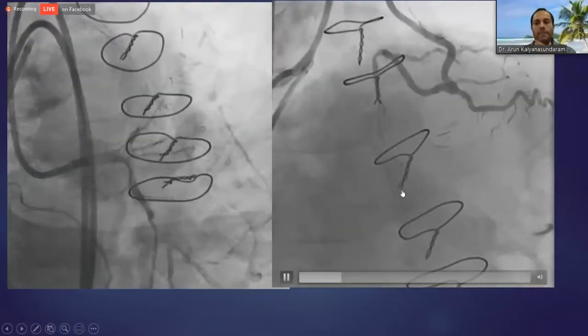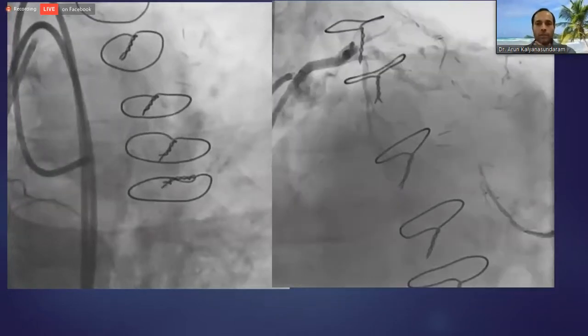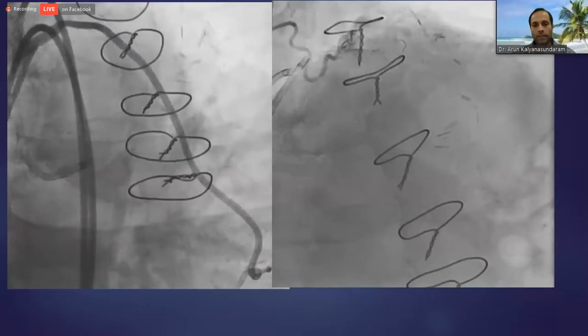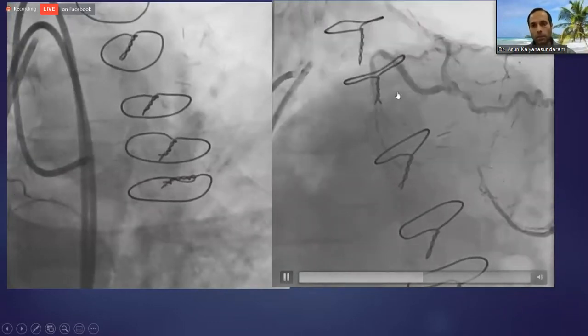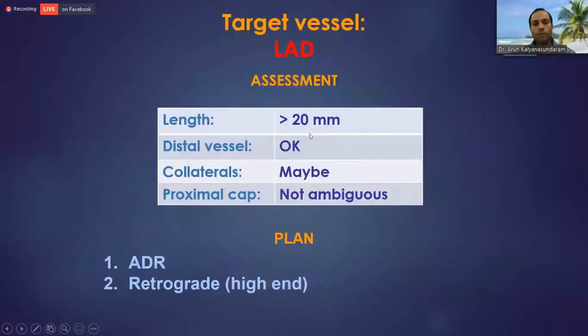Post bypass, the LIMA is gone. The graft to the circ is okay. You can kind of see it in the RAO cranial view on the right side. That's the distal part and the proximal part. So it's pretty long. You know where the proximal cap is. Collaterals are not really promising. It's epicardial through a graft into the circ and then back into the LAD, so it wouldn't be my first choice. And the proximal cap is discrete.